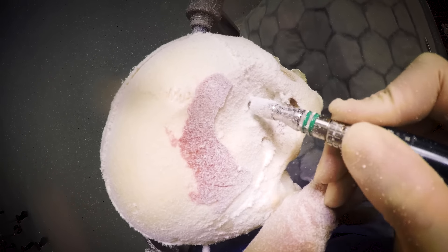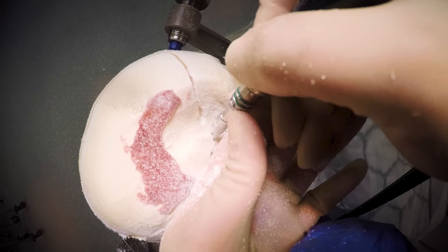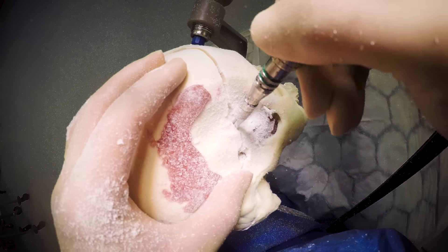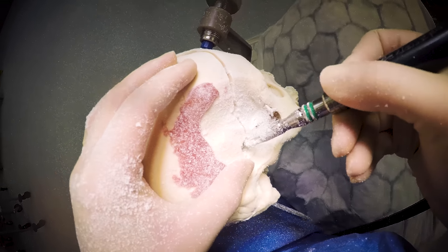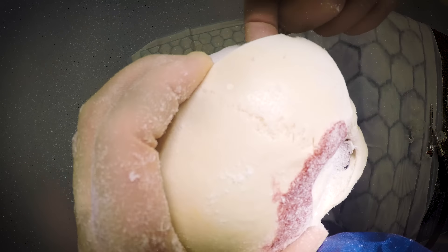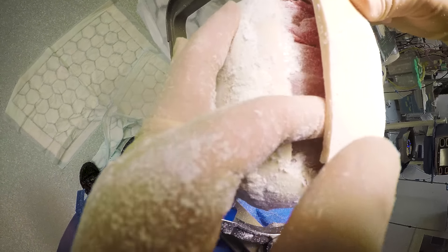As you come down through these angles, especially around the sphenoid ridge — which is a big buttress of bone — you need to make sure you've got the angle right and alter it as the case may be. Watch the left hand: place it on the bone flap so that if you make a mistake or it jumps, it doesn't fall on the floor. Peeling the bone off the dura is usually done with metal instruments called Adson smooth elevators. Always keep a hand or an assistant's hand near the bone flap in case it drops, and peel the dura off the bone carefully so you're not ripping it — though sometimes that is unavoidable.